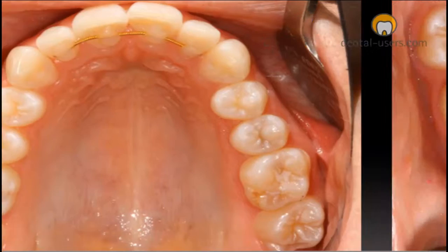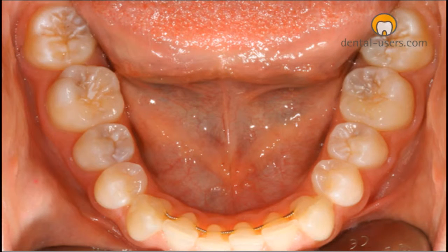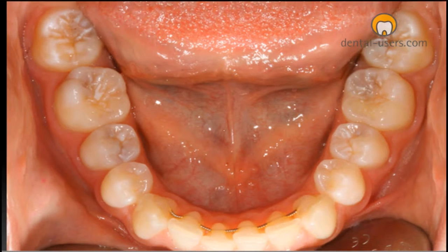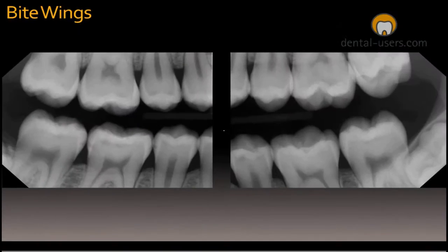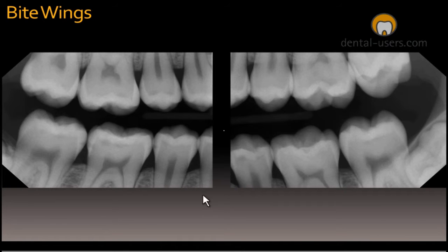This is the situation when she came to us. These are the bite wings. In some areas there is decalcification in the proximal region and a small area of decay in the proximal region.